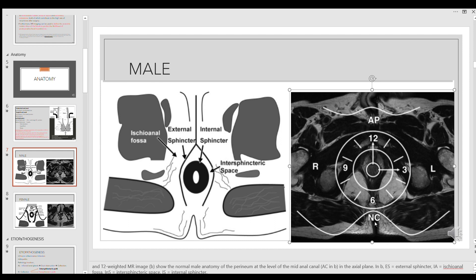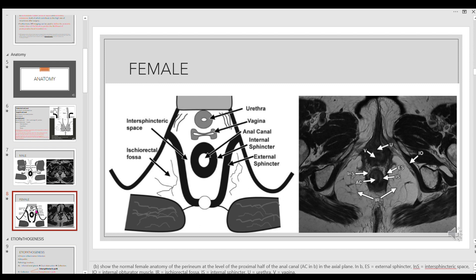Studies have been conducted with patients in the prone position. Even in prone positioning, anterior is always considered the pubic symphysis and posterior is always the natal cleft — remember this whether you are doing prone or supine, so you won't get confused with clock position. We ideally do our studies in the supine position. In the female pelvis, the dark line extending laterally is the external sphincter, and between the internal and external sphincters there is soft tissue with fat signal in the inter-sphincteric space.